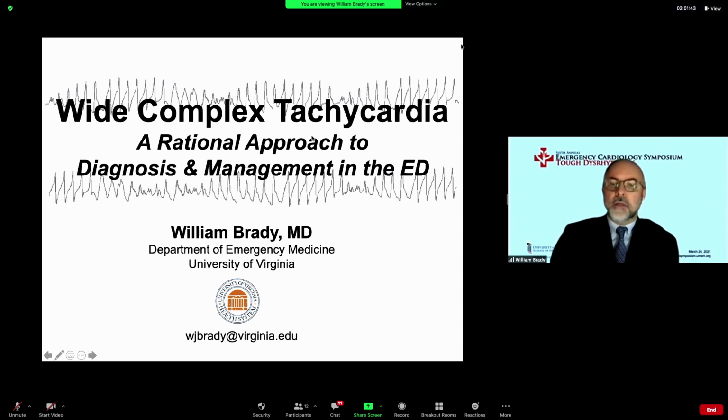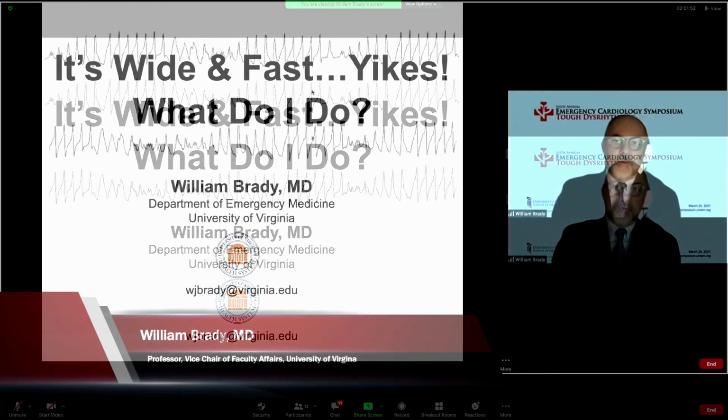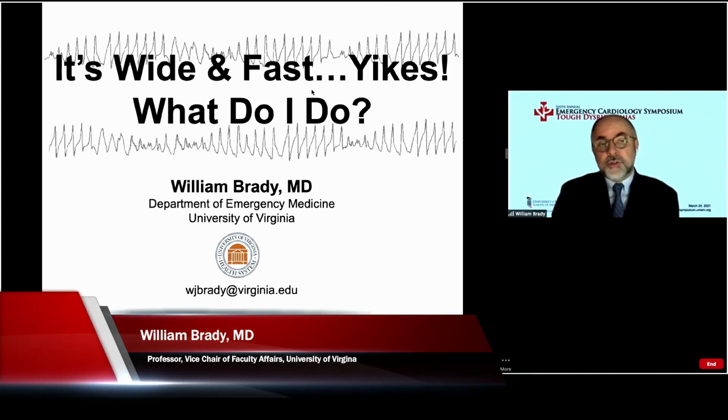So we're going to talk today about management of wide complex tachycardia in the emergency department, a rational approach to sorting out what's going on as well as what to do about it. Otherwise known as, it's wide and fast, yikes, what should I do?